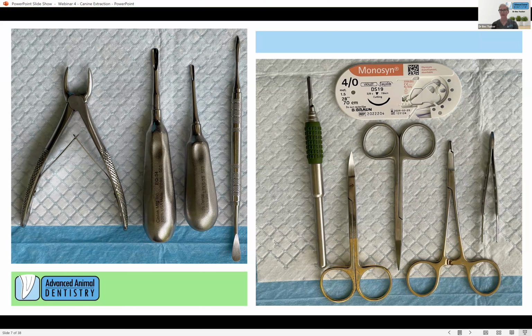Yeah, I think those needle drivers are 14 centimeters. And those forceps are a Bishop Harmon, but there's two sizes in those. We've got both. The smaller ones are too small. This is the larger of the two. Yeah. And they're just a 1-2 rat's tooth. Yeah, absolutely. That's my preferred pattern of the teeth on my forceps. I guess we can see here, we do have a pack of 4-0 here, which we generally all know the sort of size of. So yeah, the instrumentation is quite small.